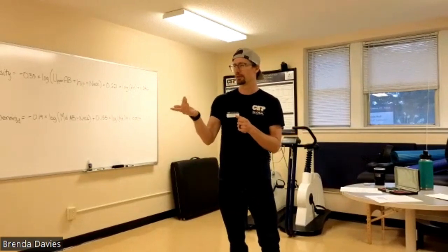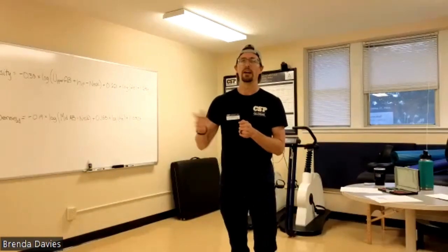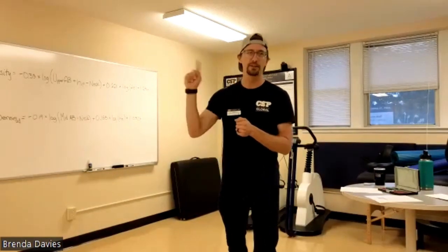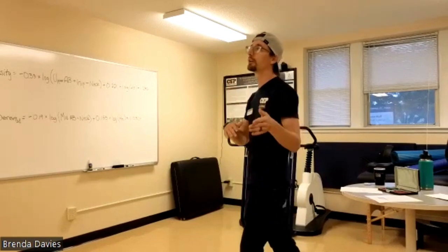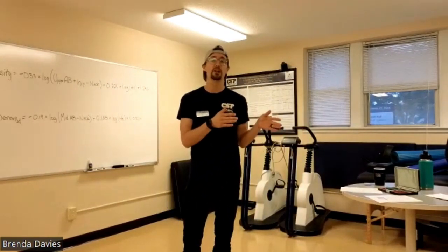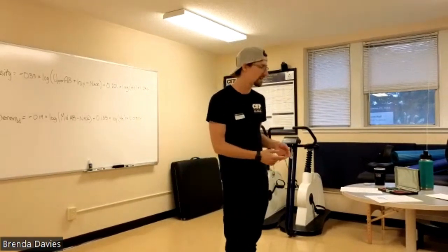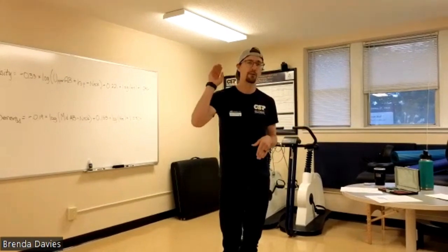Do you know what your current height and weight is? Okay, we'll then just take the cart down to the other room. We'll get both your height and weight with that. And so that's the first thing that we'll start with, because both of those pieces of information, specifically the height, will be utilized for BIA and for the Bod Pod.